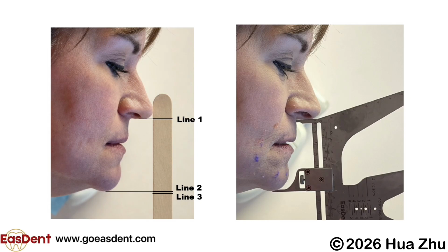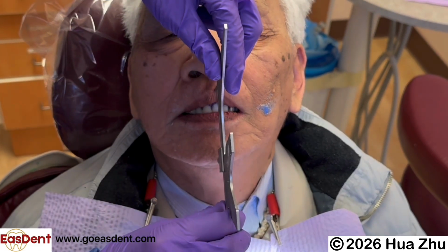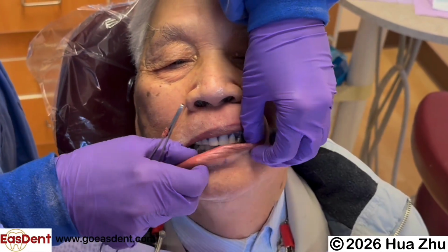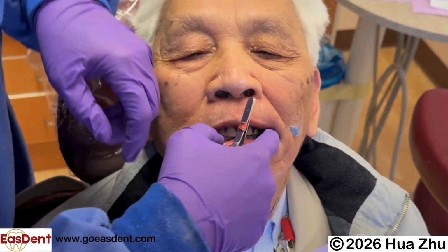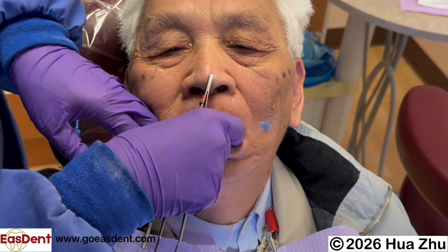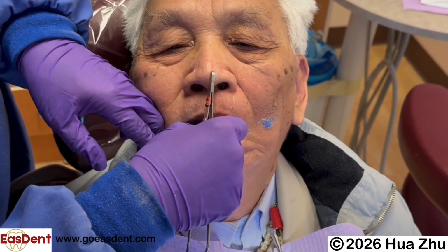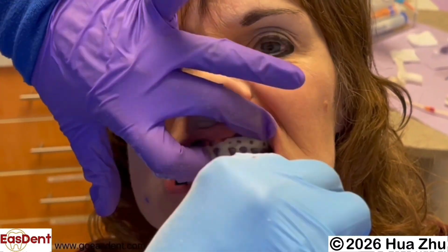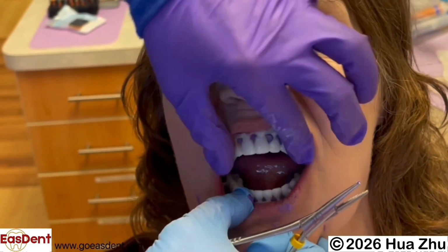Let the patient continue biting until the distance between the lower border of the septum of the nose and the lower border of the chin is equal to the preset starting VDO. Once the jaw is at the correct position, make sure the patient stays in this jaw relationship. If you put extra material, use your finger to pull the lips to mold the extra material out and remove the extra material. Remove the 4 elastomers and separate the maxillary impression with the mandibular tray quickly.